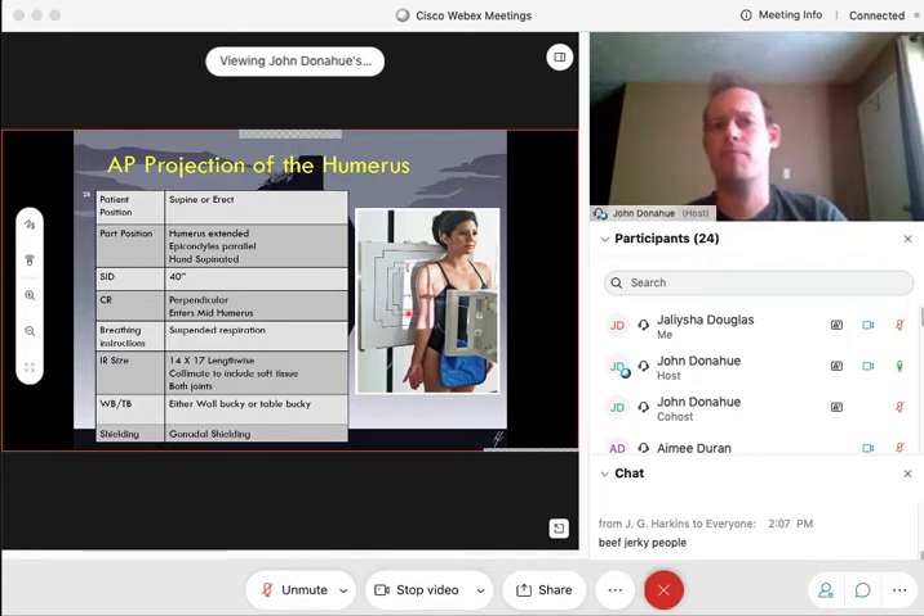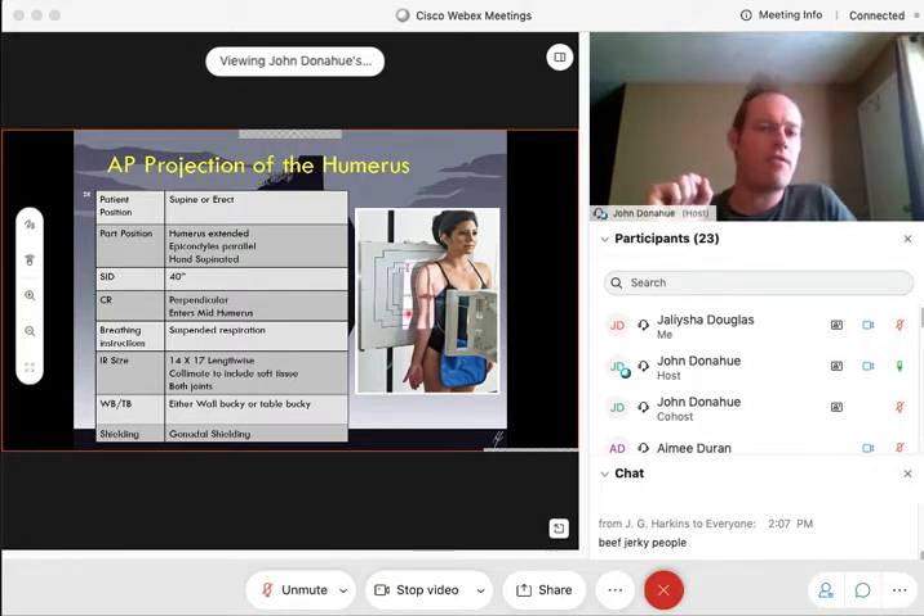The epicondyles must be parallel — you can palpate those epicondyles on the elbow of the patient to make sure they are nice and parallel. Make sure that hand is supinated, just like we're doing an AP forearm. This is going to ensure that arm is in a true AP where you don't have any laterality or obliquity going on. SID will be 40 inches, just like everything we're doing in this chapter.